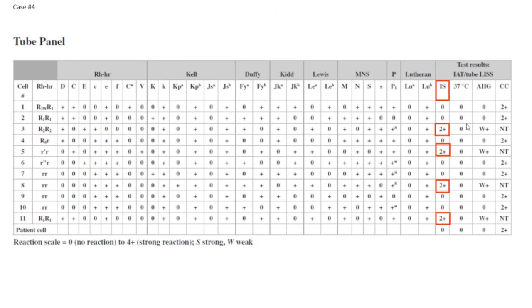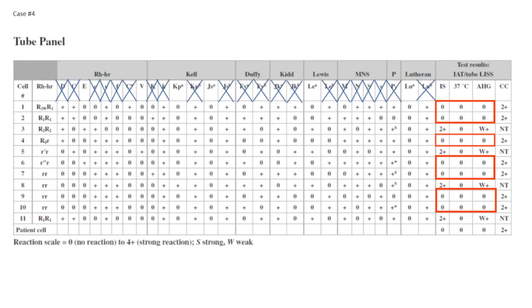So we couldn't rule out a few antigens like the Kpa or the V and the big E, but those are most likely to react at warmer temperatures. So we could isolate the Lewis A antigen. Right. That's the most possible one.